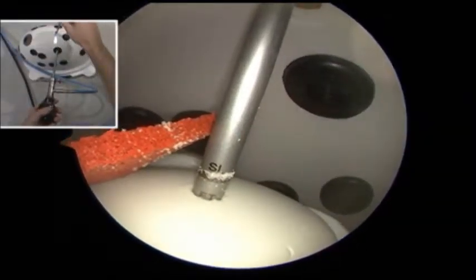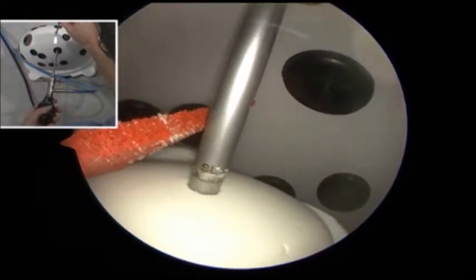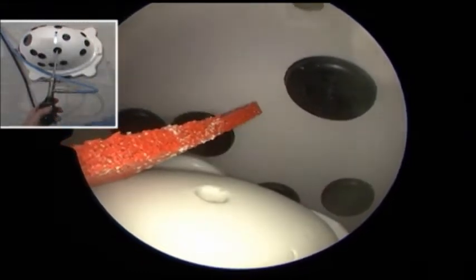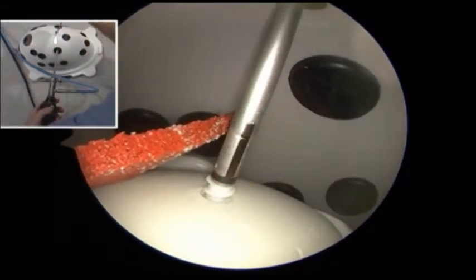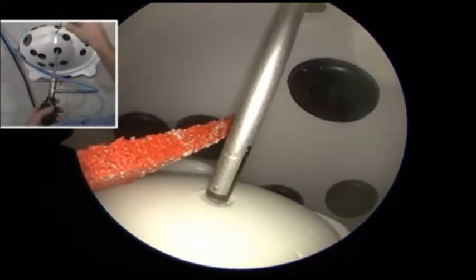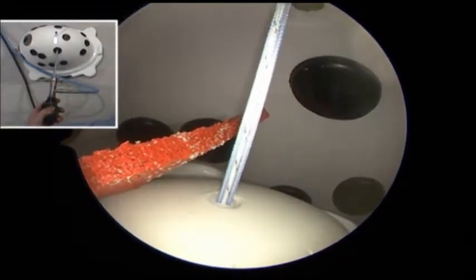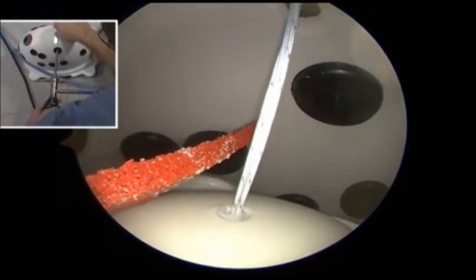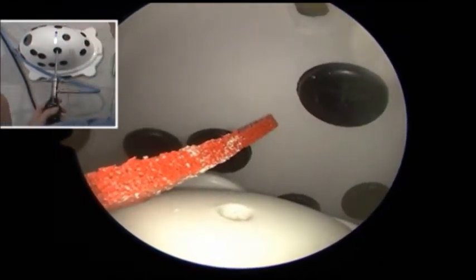So now we're going to show a little bit about what not to do. So this is us inserting the punch a little bit too far. And we'll insert our anchor through that. You can see that this goes in relatively easily. If we give it a little tug to check on the anchor, you can see that the anchor pops right out of the bone and pulls out.